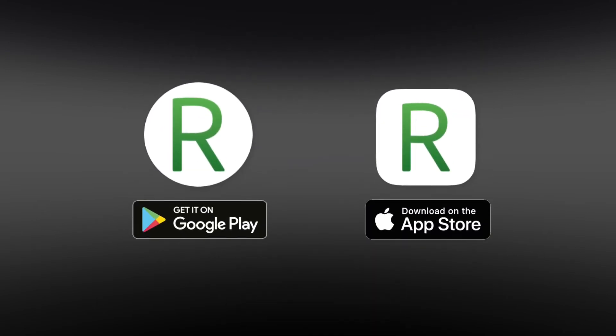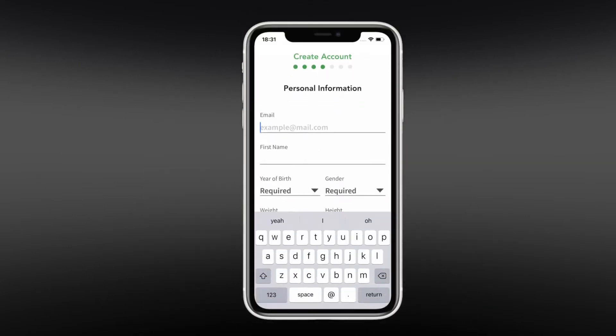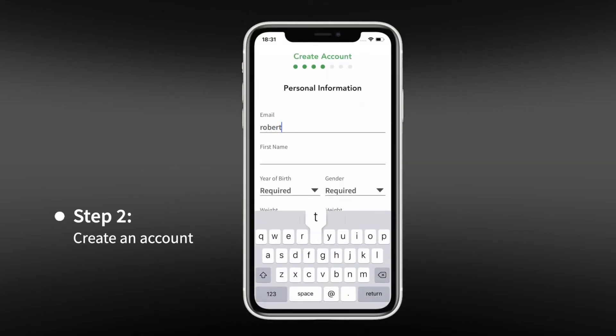Download the Revitiv app from the App Store or Google Play and create a new user account in the app. It's essential you are able to access your email account from your phone, as a verification link will be emailed and needs to be activated to complete registration.